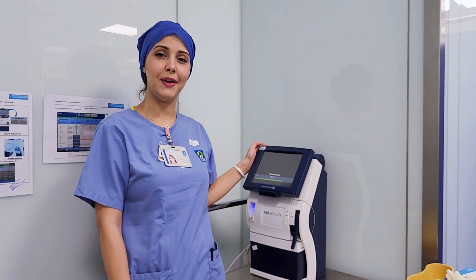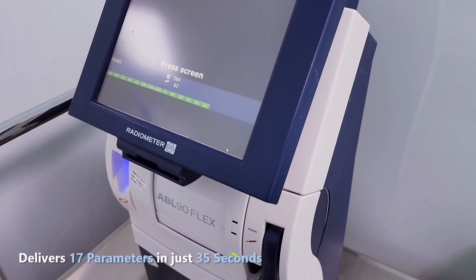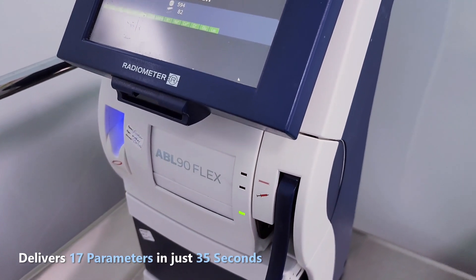We are going to talk about ABL 90 Flex. It's an automated analyzer that measures 17 parameters from a heparinized syringe or a capillary tube.